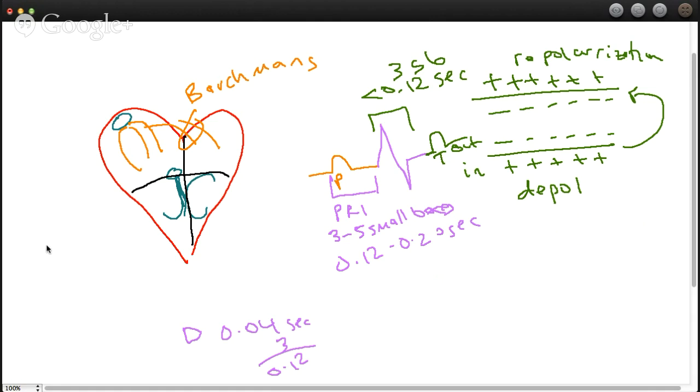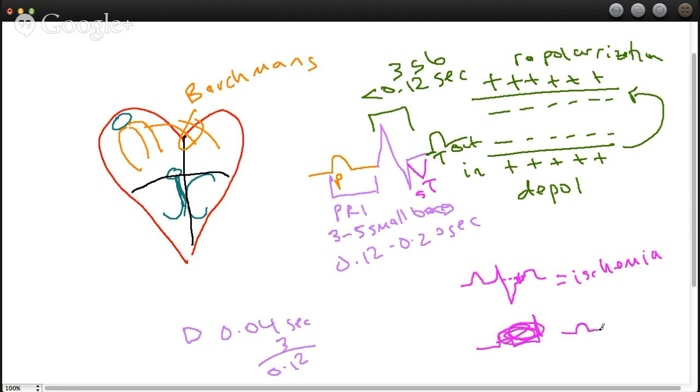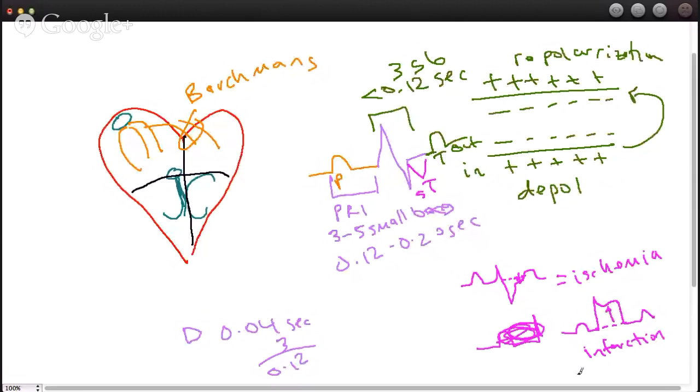Now, one last thing about this particular EKG is that we have identified most parts with the exception of this little spot right here. That's the ST segment. ST segment is directly related to whether the heart tissue is suffering some sort of injury or ischemia. Now, for all intents and purposes, I'll just tell you this right now. A condition where you have ST depression, let's say that was the baseline and you have ST depression, that indicates ischemia. And then if you have ST elevation, and so this was the baseline and you can see how it's elevated. That indicates infarction. And you can see how these look like little tombstones. So if you ever hear somebody say that they're tombstoning, that is not good. It means there are signs of infarction. And so you'll have to get to like EKG part four or five to talk about what actually, where you would see these and what part of the heart you're actually looking at.